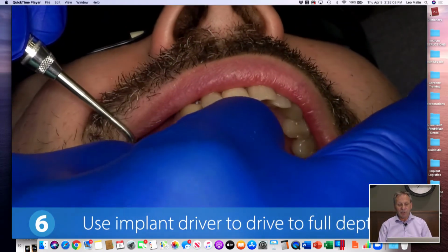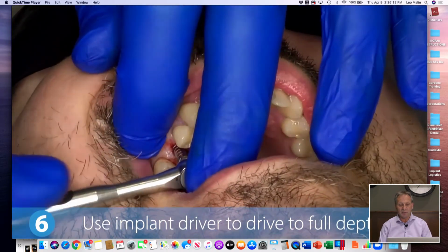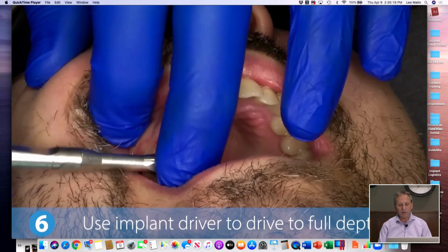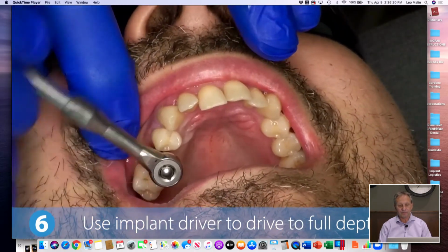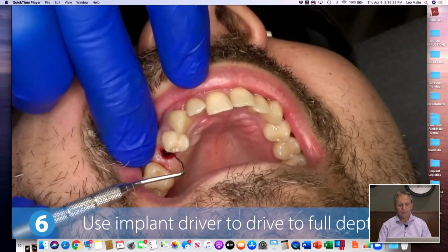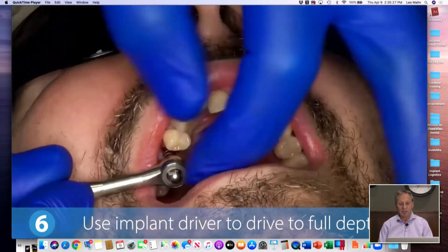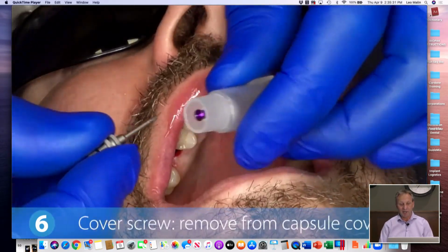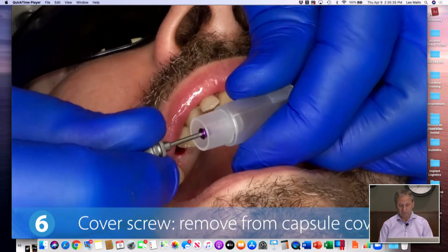This is the driver out of the surgical kit. Surgical kits are much smaller now, and we'll show you that a little bit. But now we're just going to use the hardened drivers just to drive the implant in a bit further. And then check your depth. You certainly could take an intraoperative x-ray at this point and see if you're at the depth you want to be or whether you're at the bottom of the osteotomy or not. So those things haven't changed. Those are just typical surgical things that you would do.